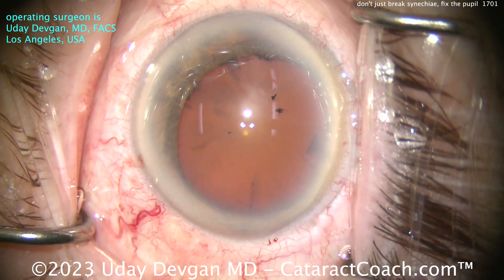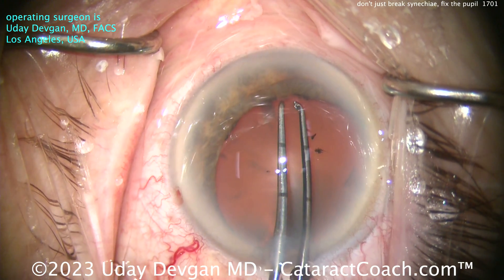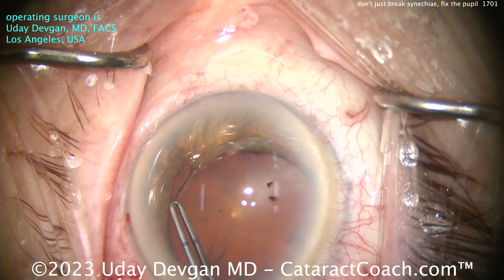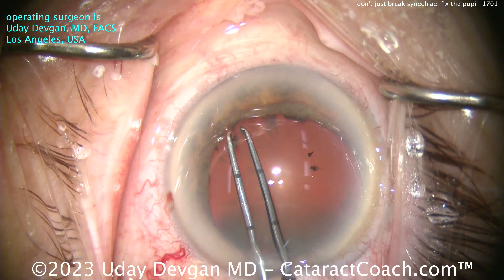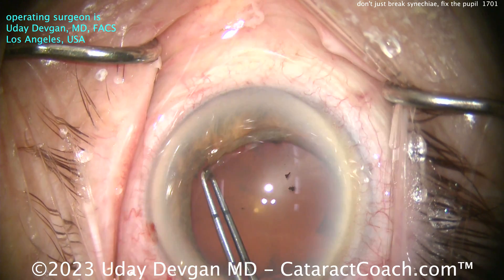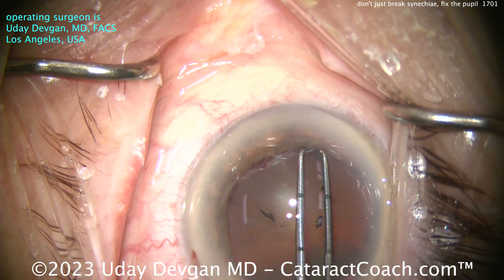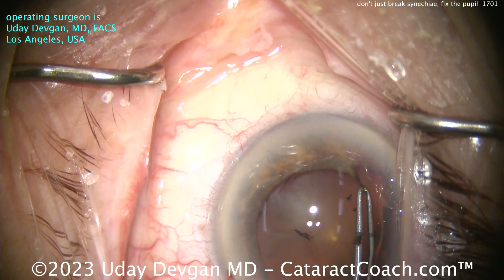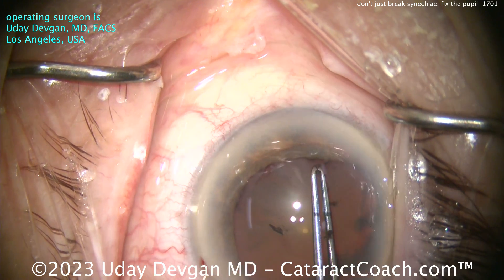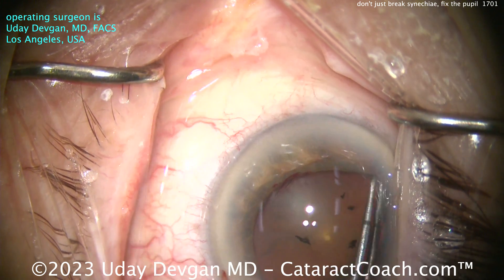Now I'm going to go in with our capsulorrhexis forceps, but we're not going to do a rhexis yet. Watch carefully. Using the forceps, I want to grab that pupillary membrane and peel it off. Now there's a delicate balance here — you don't want to yank very hard because you can disinsert the iris root, which would be an issue. But these forceps are enough to grab on that membrane and peel it off. You can see we've peeled off a good amount there. You may also notice there's a little bit of bleeding from the pupil or iris margin there, and again, that's to be expected after peeling this off.